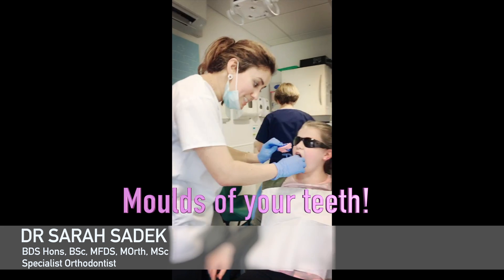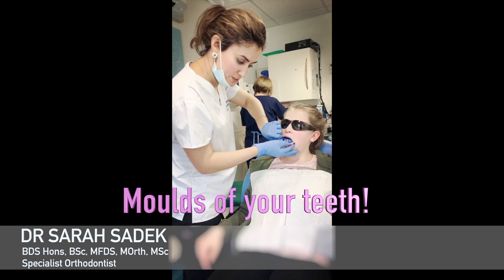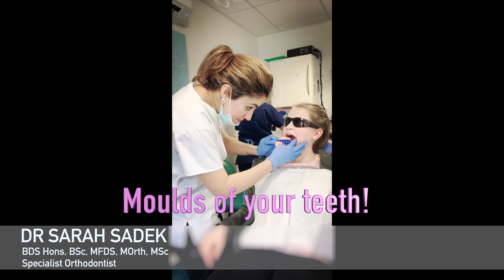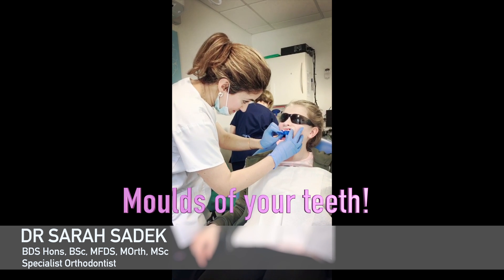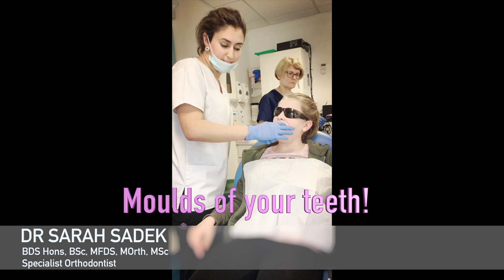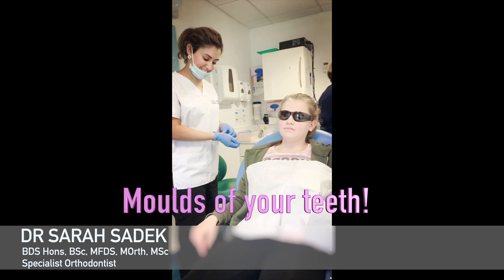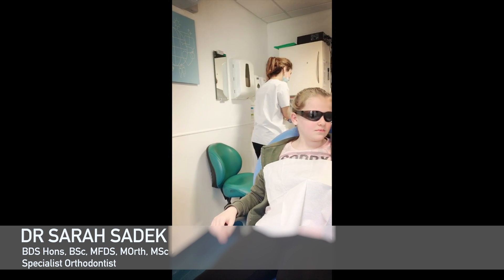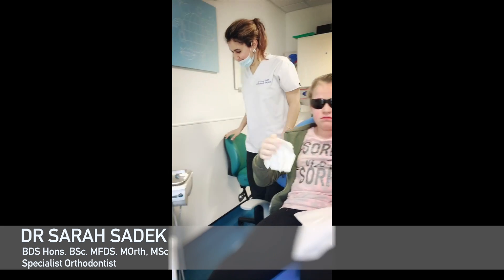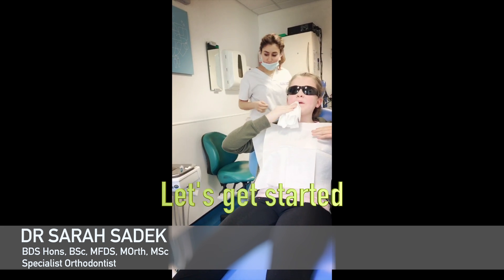A mould is taken of your teeth. This allows us to have a record of what your teeth look like at the start of treatment, and also allows the brace to be designed correctly for the best fit. The material we use to take moulds of your teeth is called alginate — it is seaweed based and usually takes around 30 seconds to set. You won't swallow it, however sometimes it can make you gag. The most important thing is not to worry about this stage because we have lots of great techniques to help you avoid the possibility of gagging.